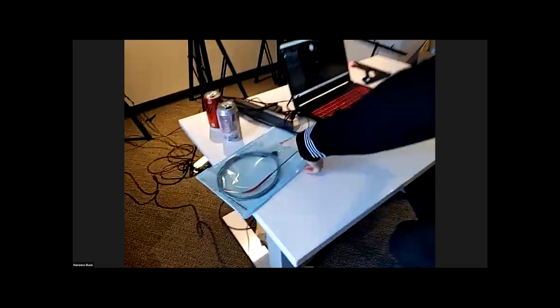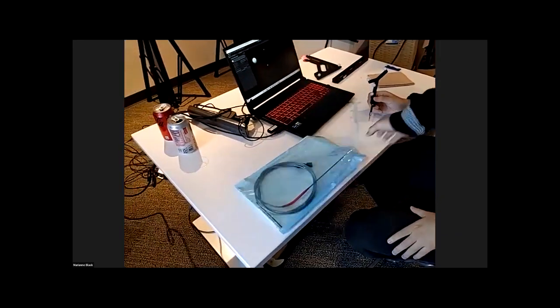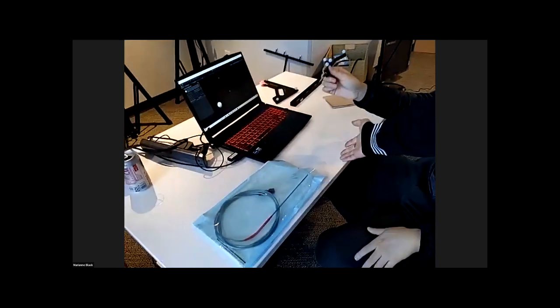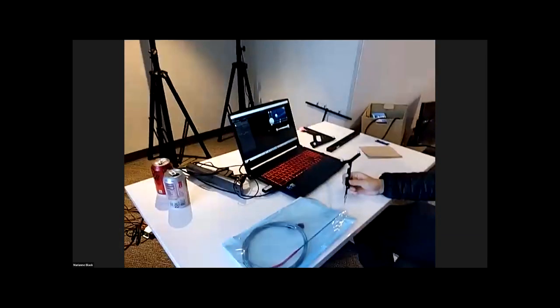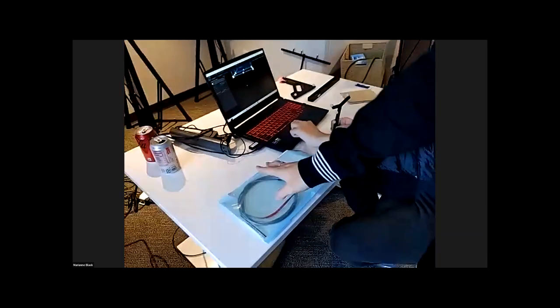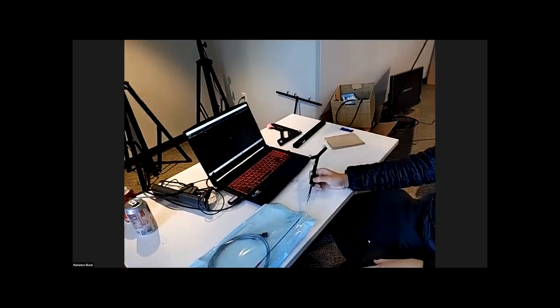This is the actual needle that is used in the surgical procedure, and this is just a representation of the needle that comes with the OptiTrack system. You can really attach any needle. Yes, we can attach the marker. Those OptiTrack markers are tracking the needle position in real time. Lots of questions on this.